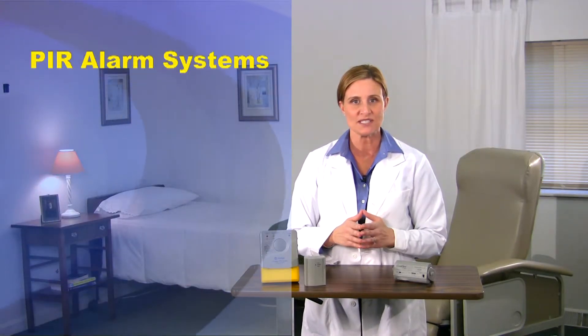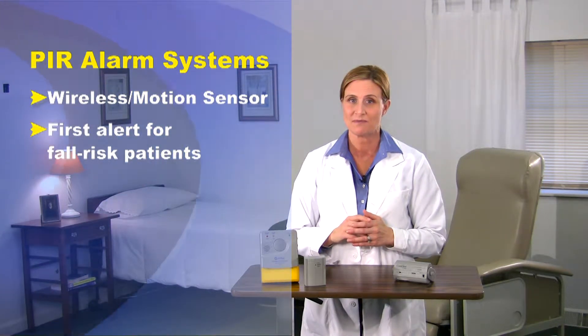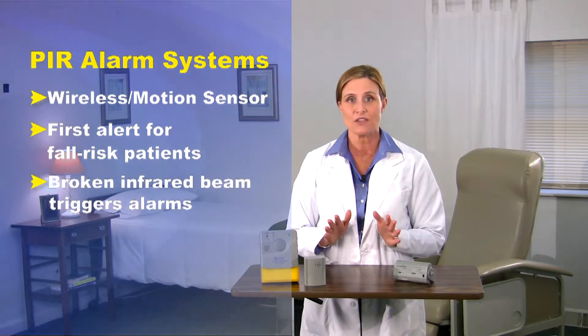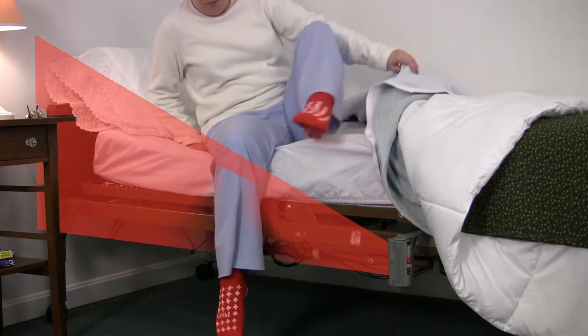But just to quickly review, the PIR is a wireless motion sensing alarm that acts as a first alert to patients who are about to rise from their bed. It uses infrared technology to create an invisible field that triggers an alarm once the sensing field has been disturbed. This presentation takes a closer look at System 4 and explains the benefits specific to this system, its components, setup instructions, and how to use it.